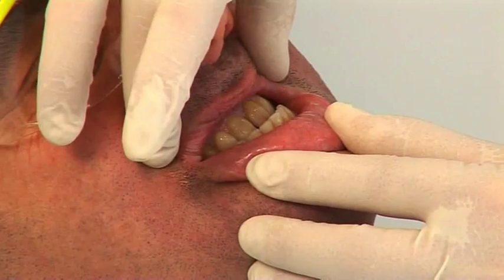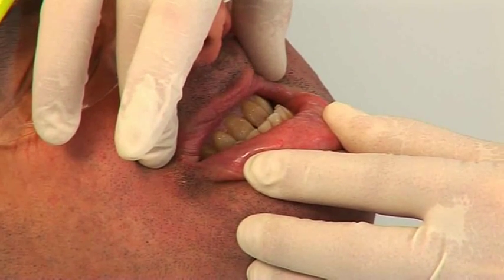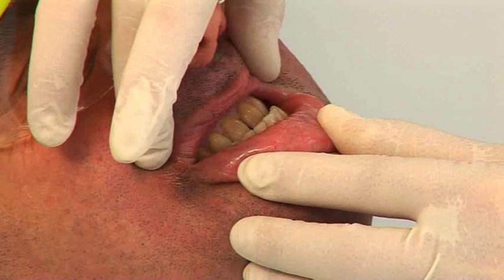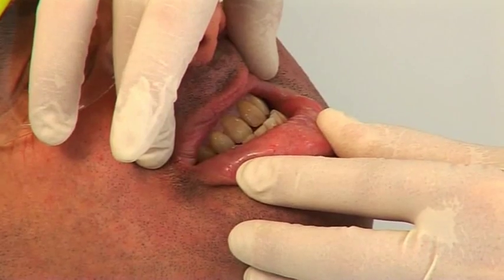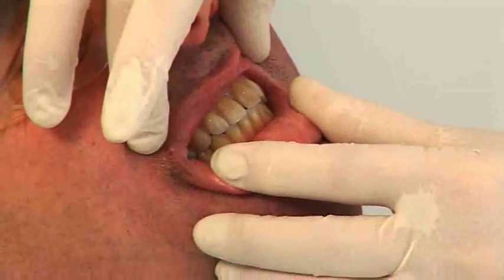A lot of patients when they protrude their mandible have a tendency for some deviation to either the left or the right side. In Simon's case there's a slight deviation to the right side. Now just go back to your normal bite. Tap together.